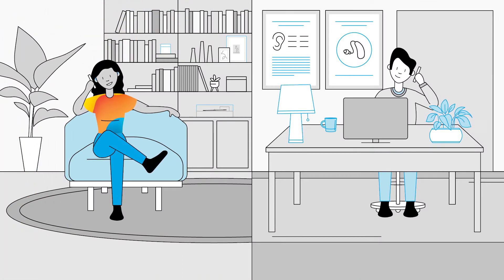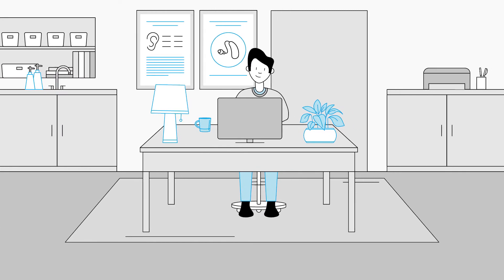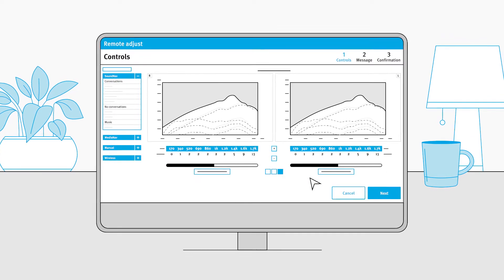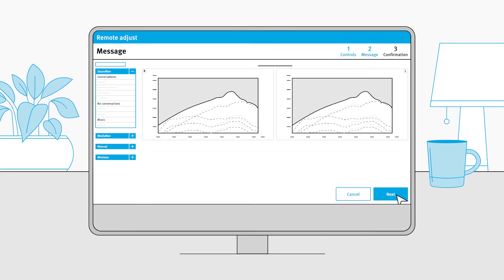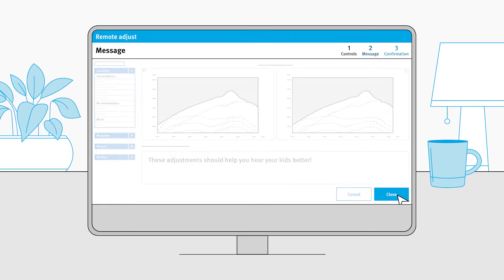Set up a quick call or even an email to learn about what adjustments are needed. Then, when it's convenient for you, simply start a Remote Adjust session in TrueFit fitting software. You can make unique gain offset changes for each program available on the hearing instruments in the automatic, manual, and wireless streaming programs. Once the adjustment is ready, write your client a message and send it off.